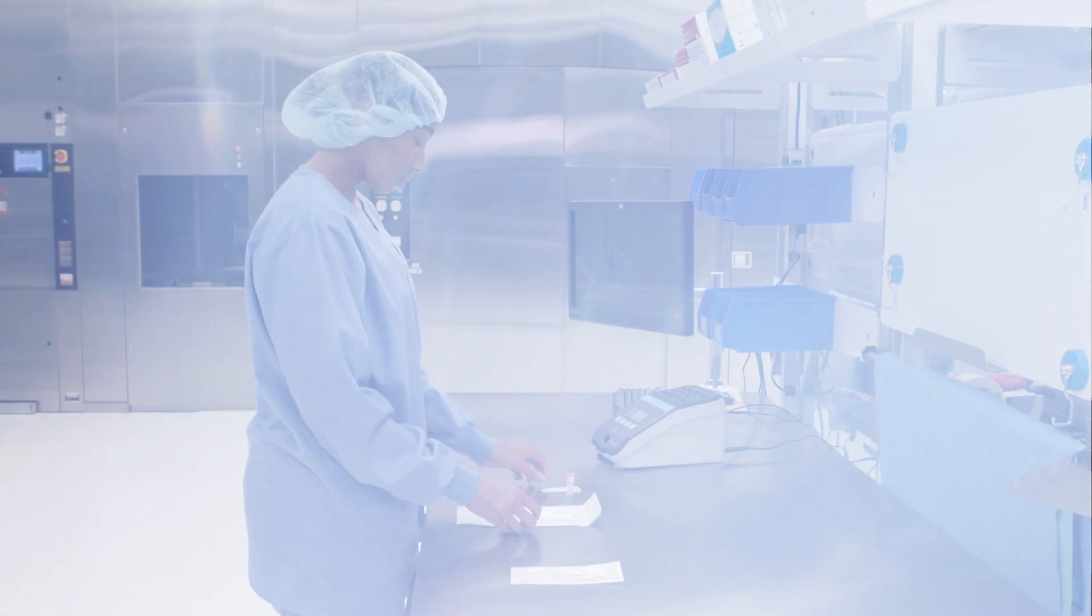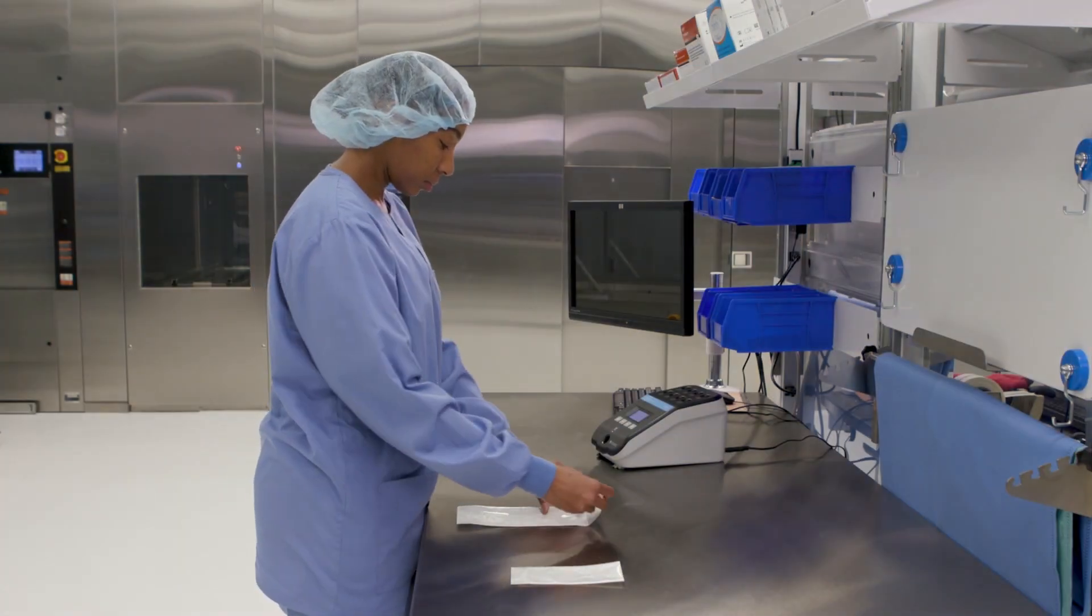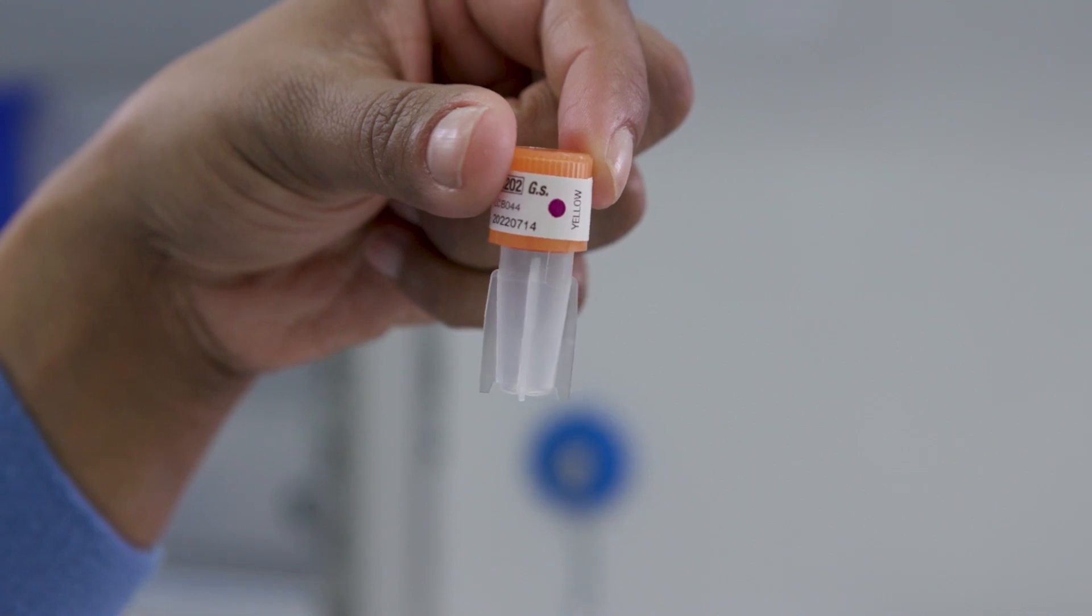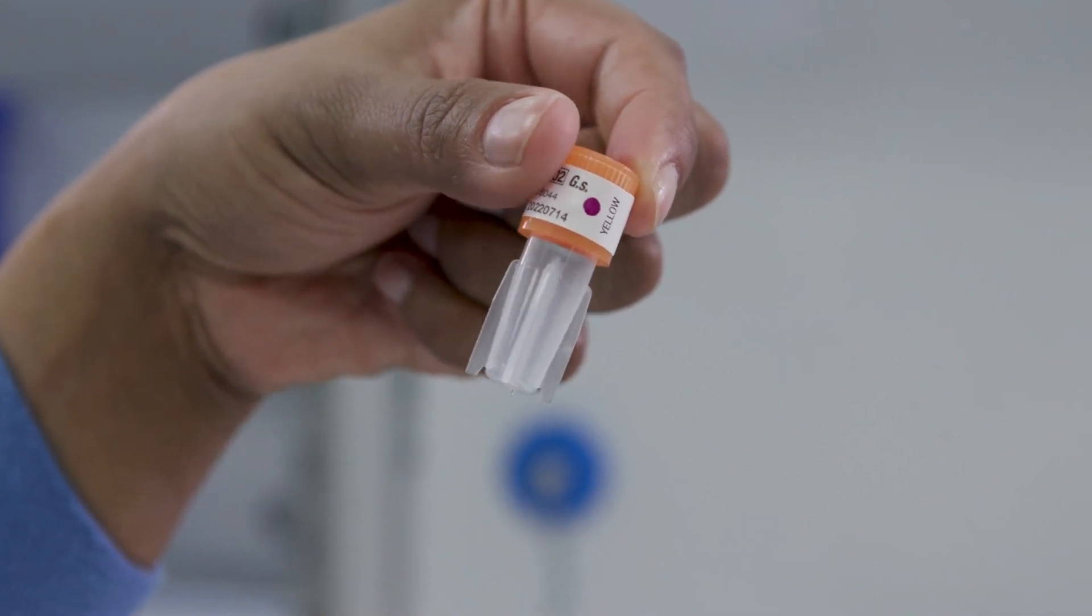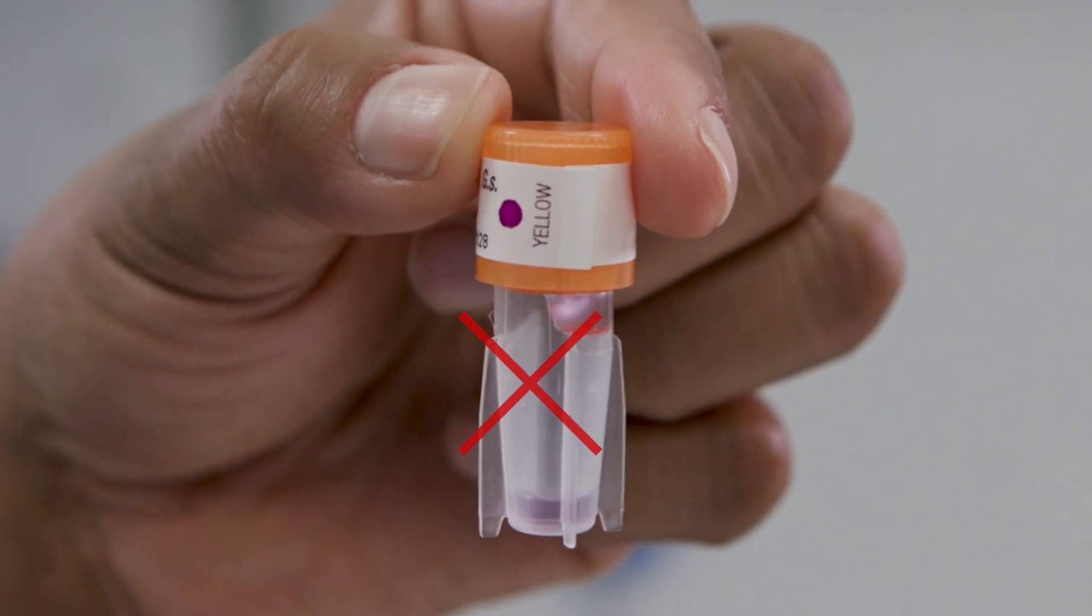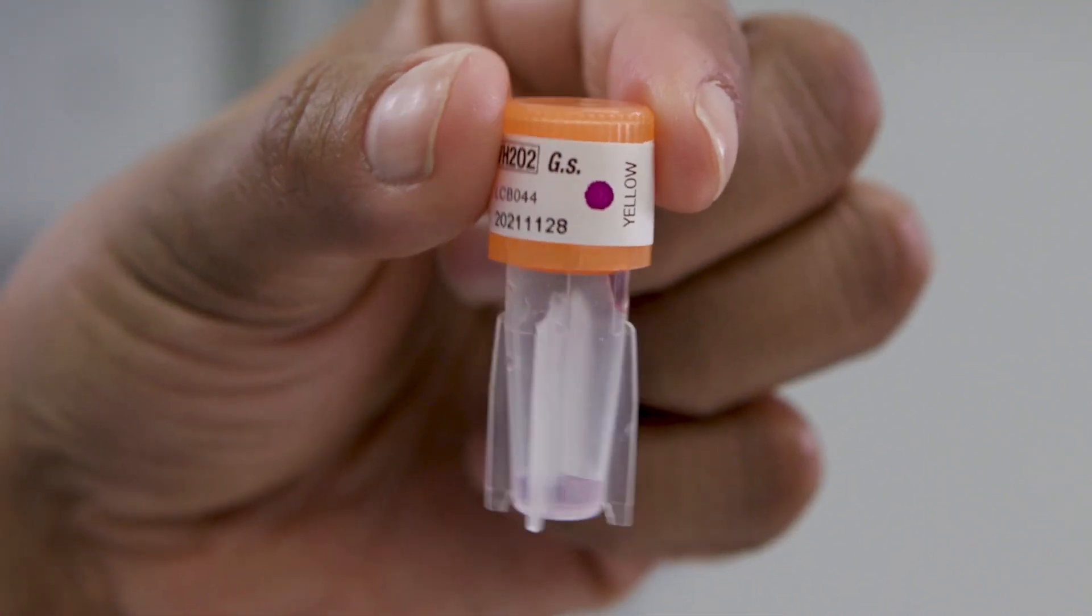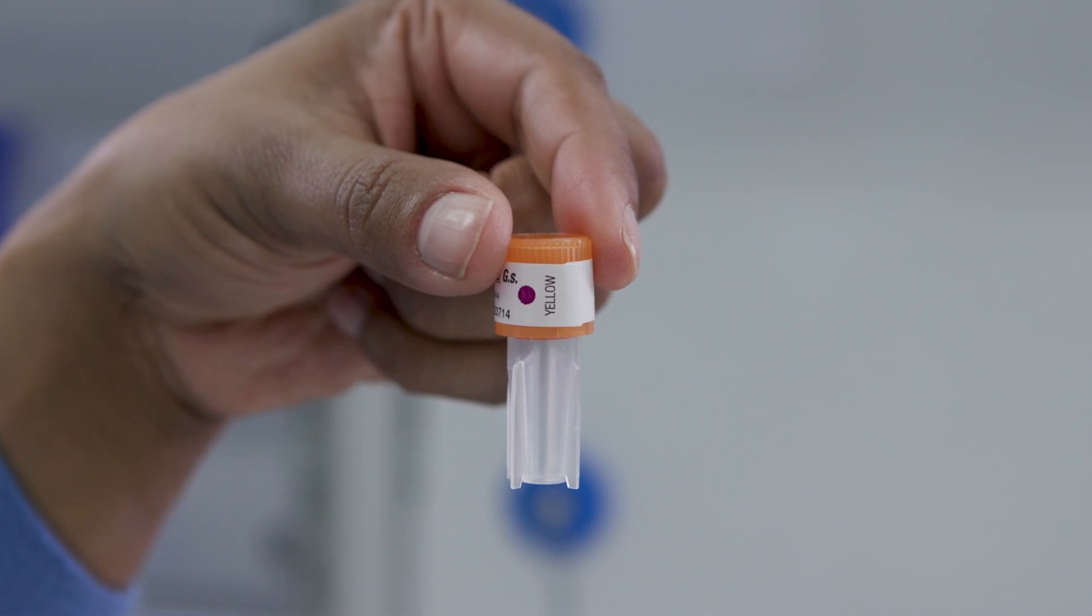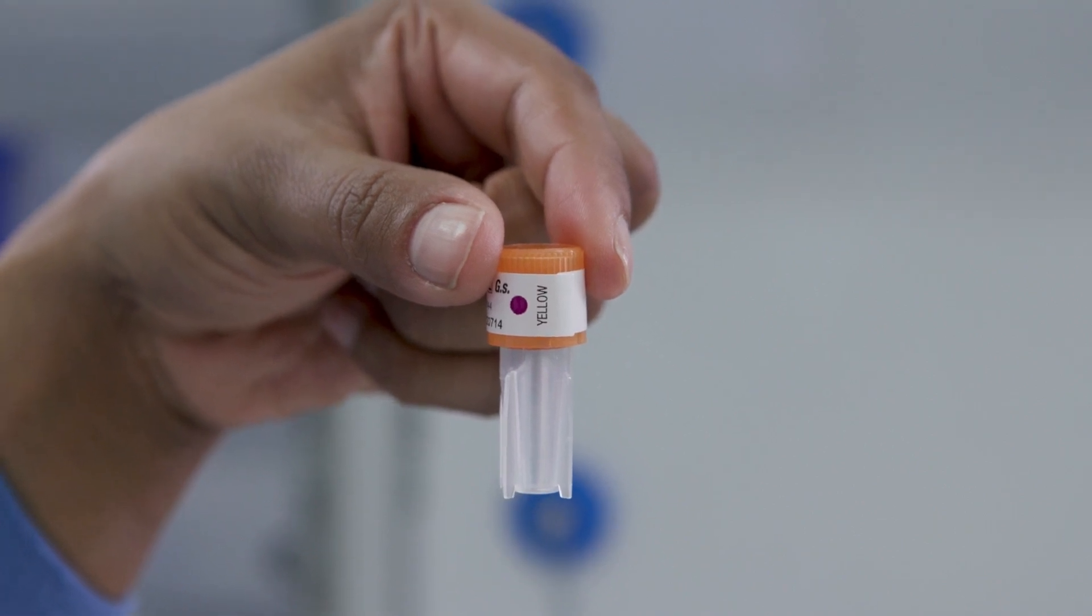To perform routine monitoring, the Celerity HP BI must be used within an appropriate test pack in a loaded chamber. Prior to using the BI, inspect the vial to ensure the media-filled cap has not been prematurely activated. No media should be present in the vial prior to activation. Inspect the process indicator label on the cap and confirm the indicator color is magenta.